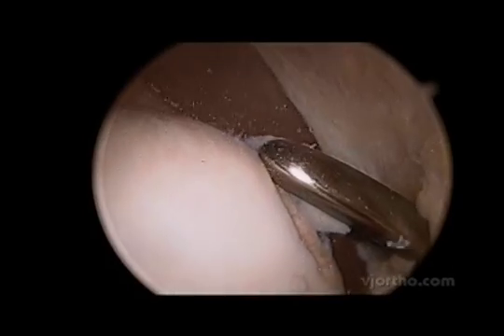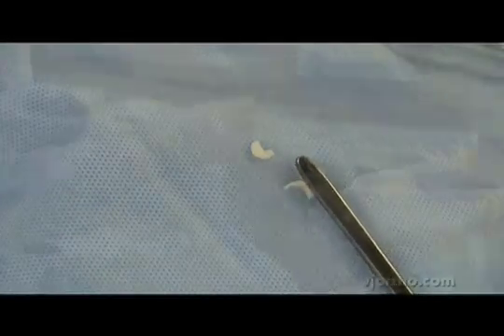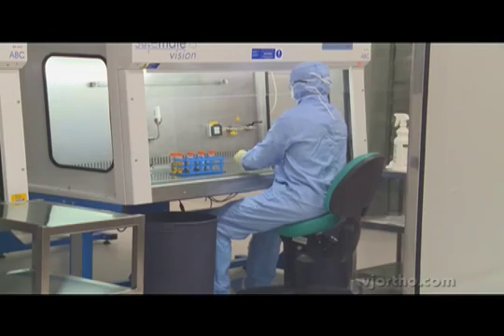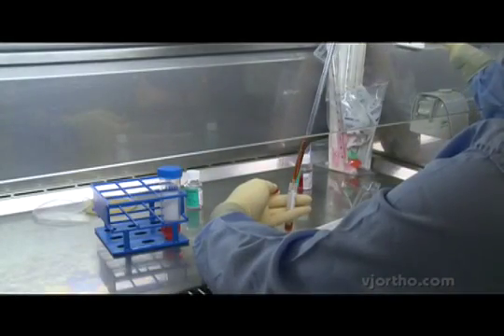We then retrieve it with a pituitary rongeur. The biopsy is then placed into a transfer medium and sent to a Genzyme facility where it is mechanically minced and then digested to isolate the chondrocytes.